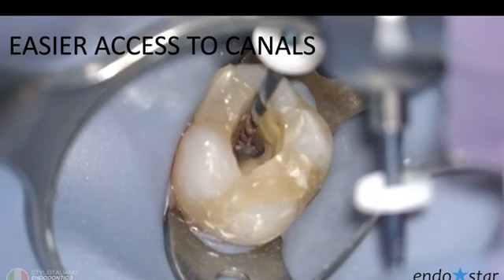I don't know if you are seeing now the video. There is a small delay. I was showing in this video that I can go inside the canal by pre-bending the instrument. I can reach the orifice easily in difficult access in molars.